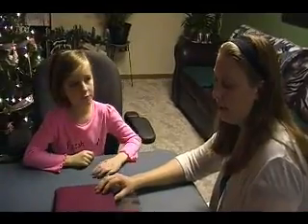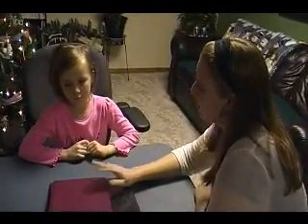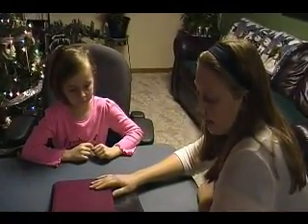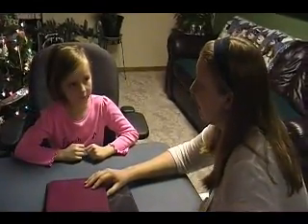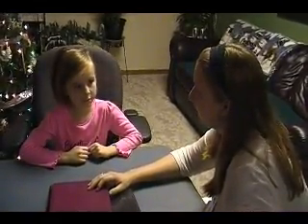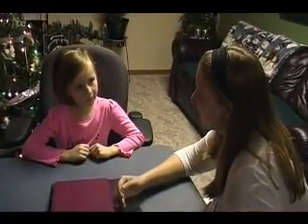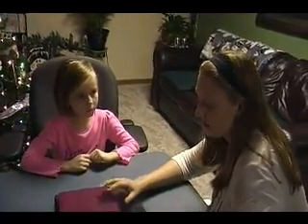So today we looked at how to turn it on. You learned that. You were very good at that. We looked at the picture board, some examples and stuff like that. Now, next time I'm going to have you bring the iPad along and we're going to see how well you're doing with the communication board. If you need a different one, we'll get one that's a little bit harder, one that has quite a few more options.